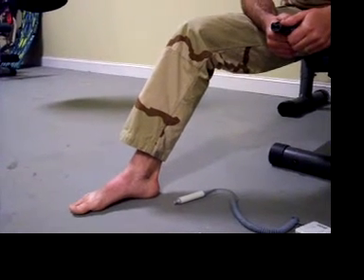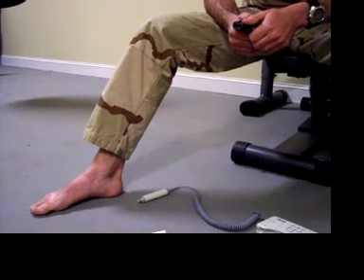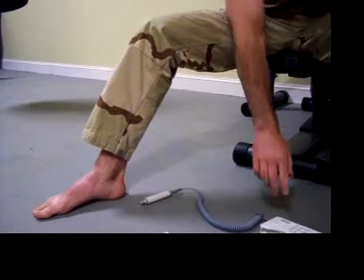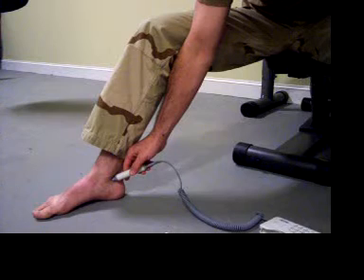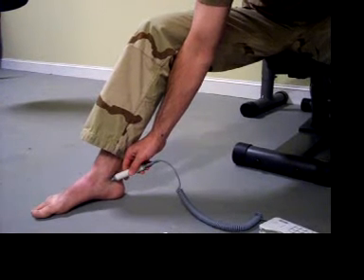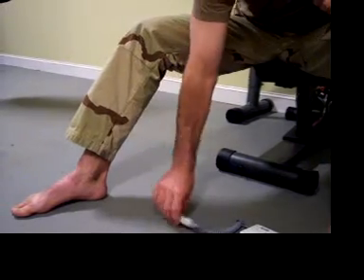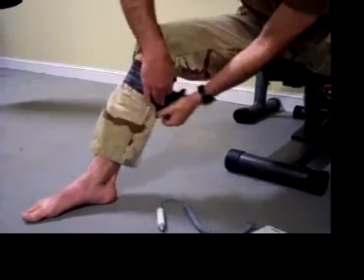We'll now simulate injury to the right lower extremity, in which we'll be applying the SWAT-T as an arterial tourniquet to stop the bleeding. After the time of injury, the SWAT-T will be taken and wrapped around the extremity.